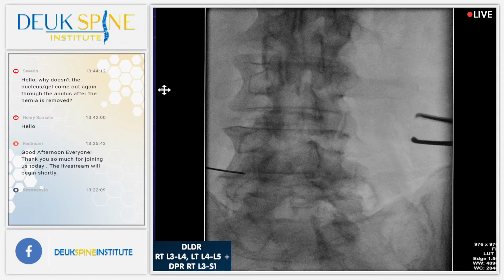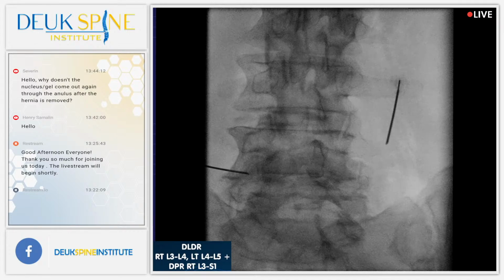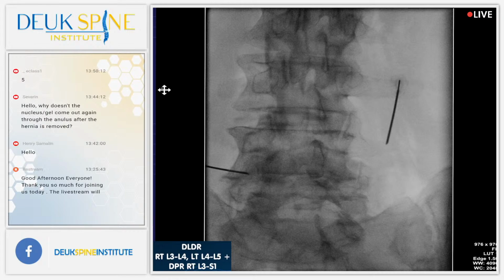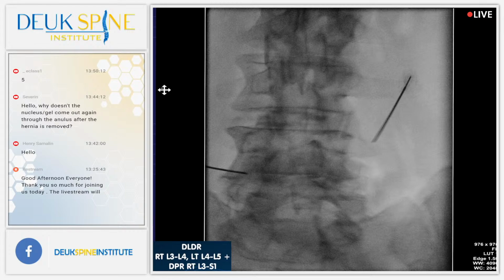So, all right. Now I'm going to go through the same incision, and I'm going to head down to that next target, which will be shot. It's too high. Shot. That's a little bit better, but too lateral. Shot. That's very close to where we need to be, actually. And I feel the bone, by the way. I want to be a little bit more medial. Shot.